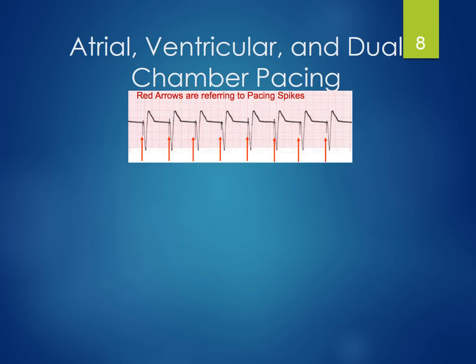So let's look at a normally functioning pacemaker first. The purpose of that pacemaker is to deliver an impulse which causes the heart to beat, right? So we should see a pacer spike immediately followed by a sign that our heart is beating, which is our EKG complex, our PQRST. Now remember, with transvenous and epicardial pacing, we can actually specifically pace the atria and maybe the ventricle.